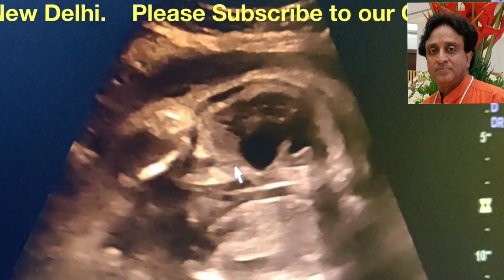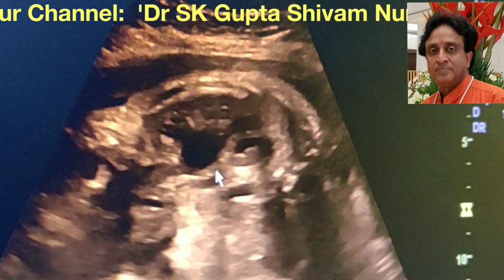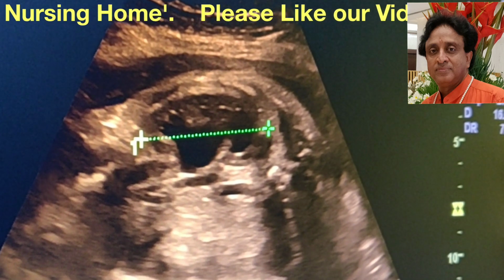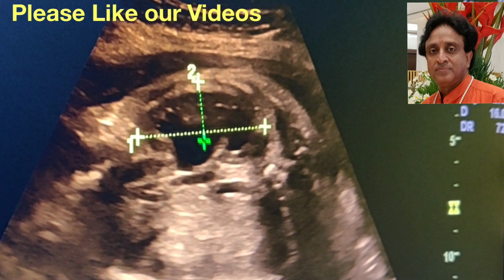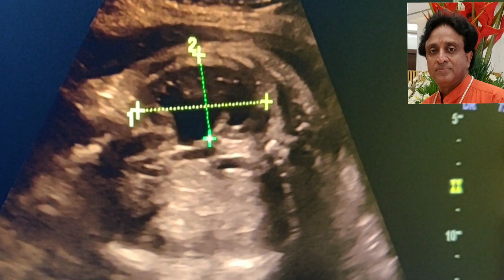This way we have been able to demonstrate that there is unilateral hydronephrosis in the kidney, and if I measure the kidney, you would see that the kidney measurement is pretty big in size. This is the kidney from here to here, 51.9 mm and 28 mm.